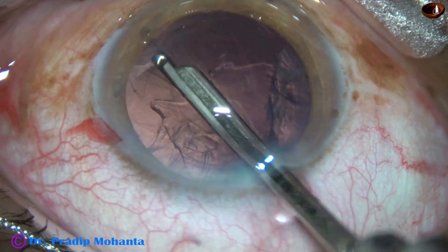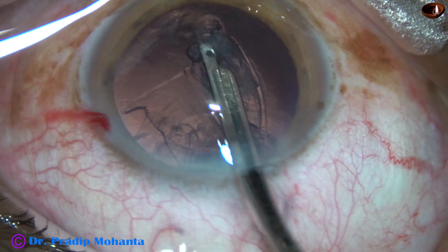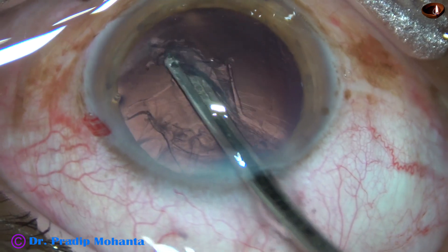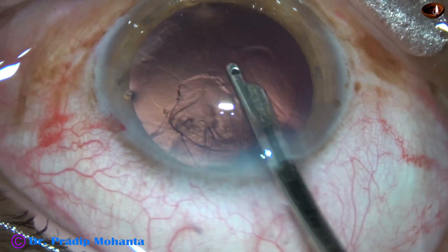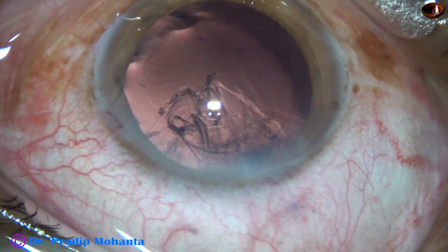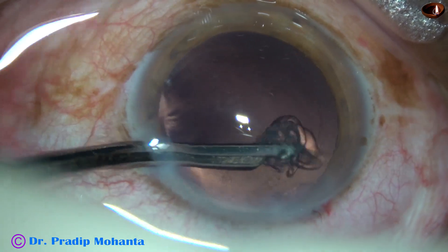This technique is very safe for the posterior capsule and very safe for the corneal endothelium. The cornea remains crystal clear, and the equator resting on the posterior capsule actually protects it. Thus, this technique is very safe for managing soft cataracts — grade 1, grade 2, or grade 2+ — very easily and very safely.